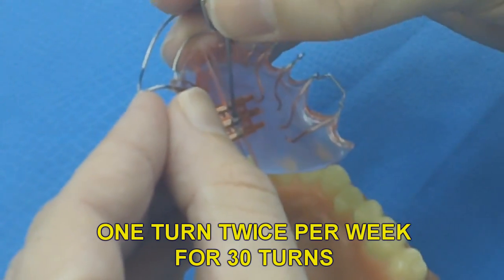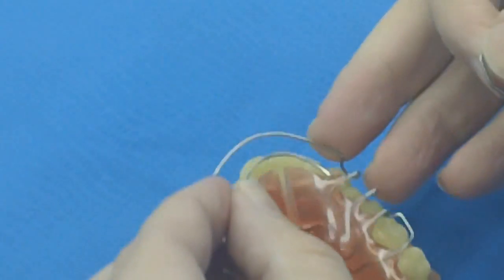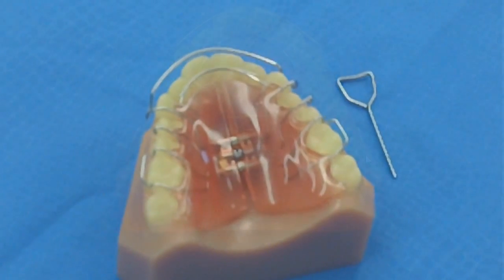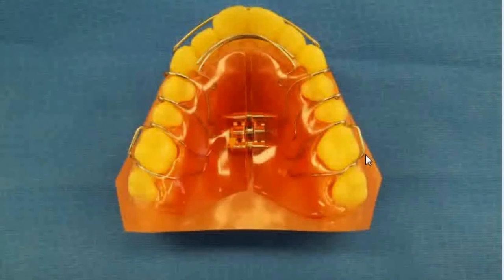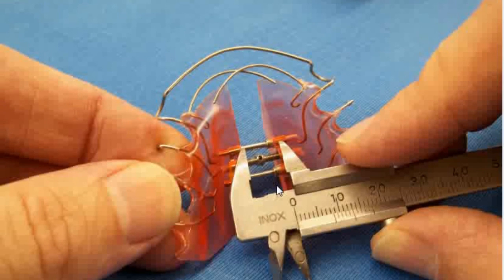Sometimes this is too fast of a turning schedule for adults. If the patient is riding up the lingual of the posterior teeth and does not fit like it should, you may want to have the patient turn the screw 1 turn once a week. To determine how much the appliance has been activated, measure the distance between the cut and the acrylic. This will tell you how much activation has been done and how much more you can achieve with this appliance.